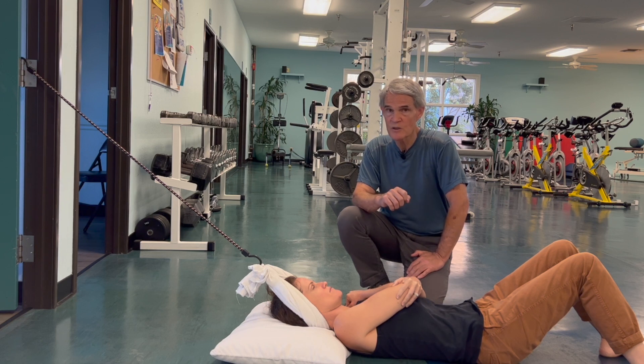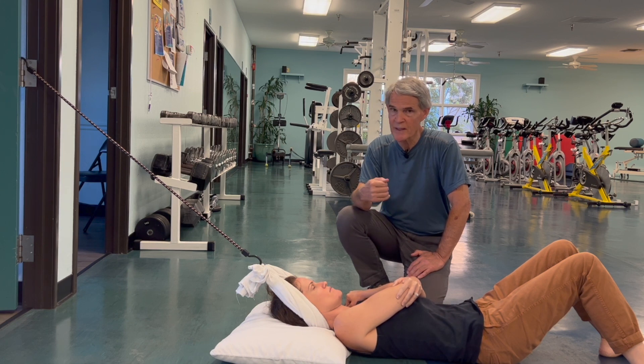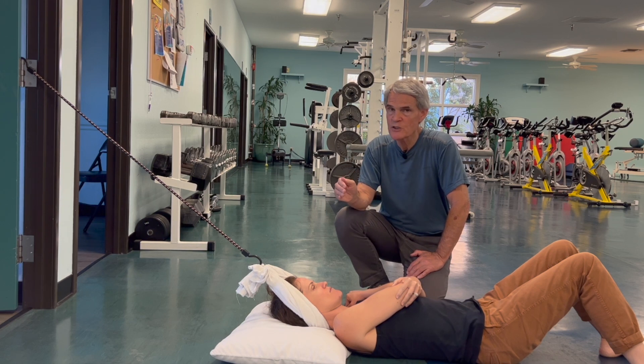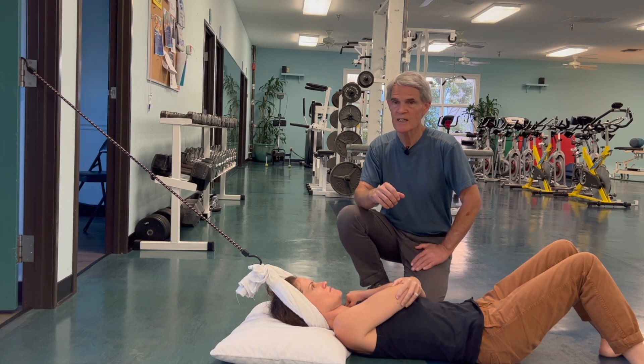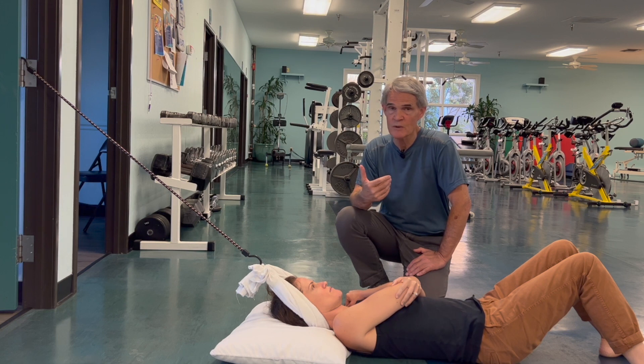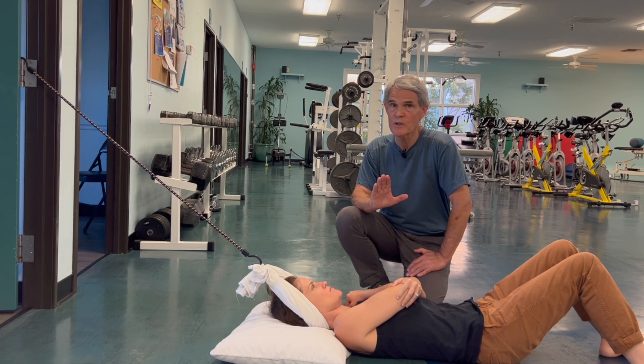It can be a very nice way to treat an irritated neck, but be careful about not applying too much traction. When starting out, test it slowly — maybe two minutes, very gentle. Once you know it's okay, you can add a little force and a little time. When the neck is not irritable, it might feel good to be here for 20 or 30 minutes, but that's not where you want to start.